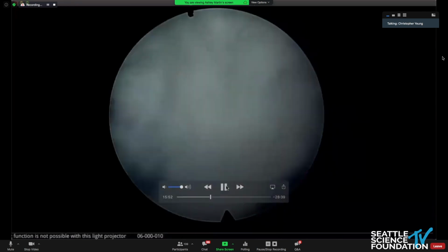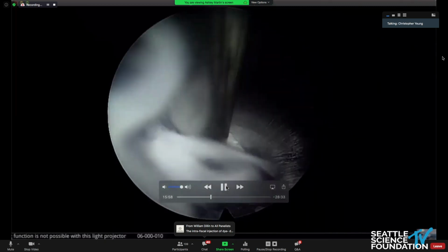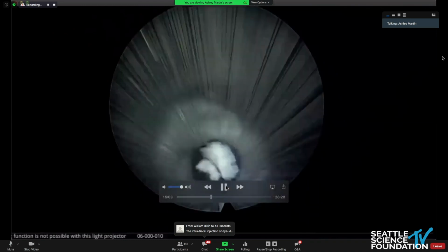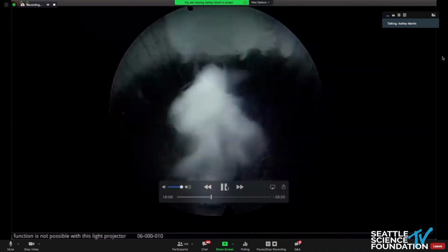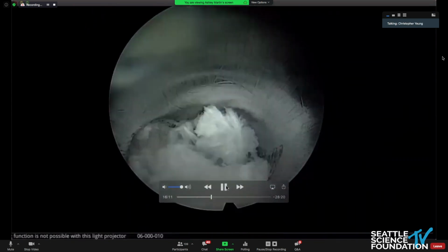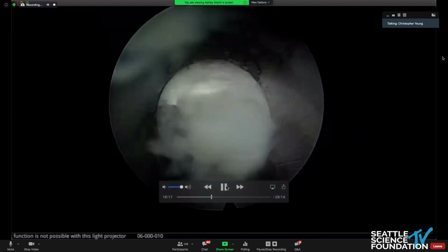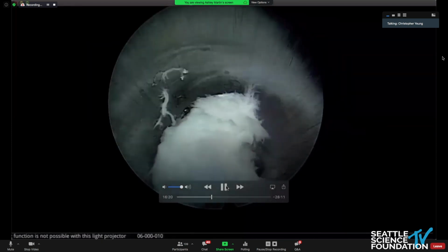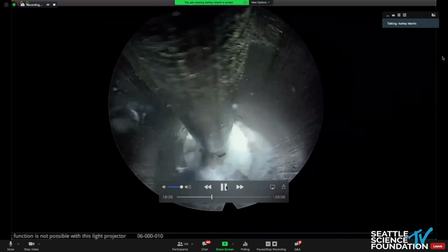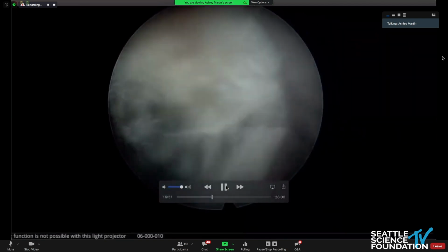We're pulling it out, and just cleaning up and making sure that it's all decompressed. So we got everything that we can see really quickly in the frame. It's also notable that we have this endoscopic pituitary. It goes down the scope through the working channel, and that way you can directly visualize what you're removing. Grab that, turn the water flow down. So about a 3 millimeter or so pituitary.